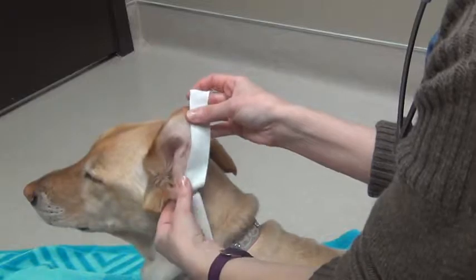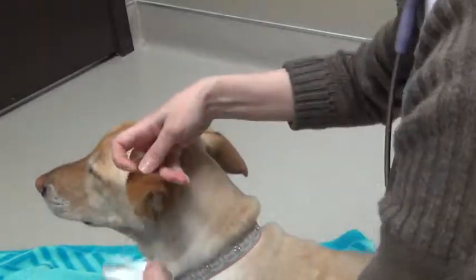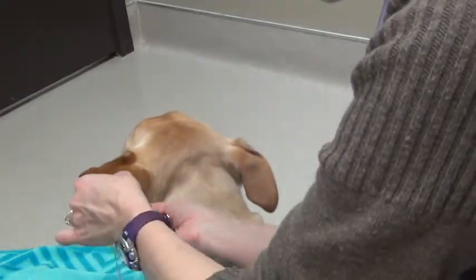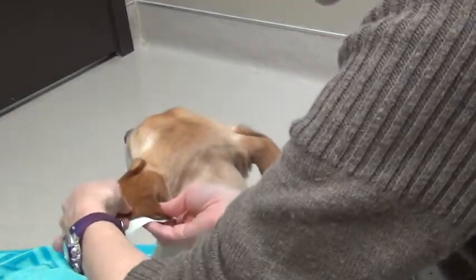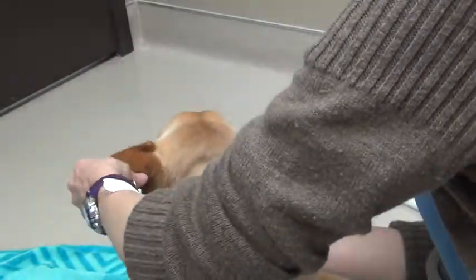We did watch the instructional video and read our text about the application of the hematoma bandage. So we're just going to come to the outside margin of the ear. We're not going to cover up any of the pinna. We're just going to basically use the pinna as a foundation for the tape.